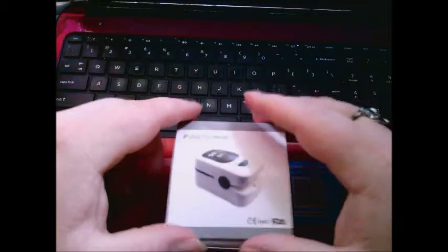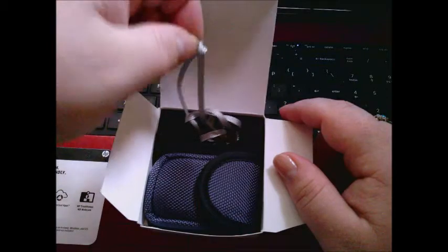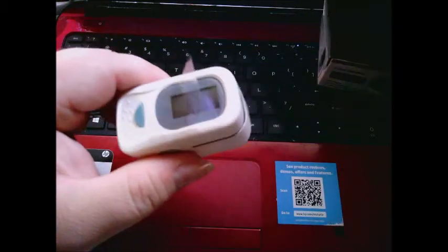Opening up the box, we have this little lanyard right here, which is nice, and then this really nice, well put-together pouch. It also includes warranty information and basically instructions on how to use it.